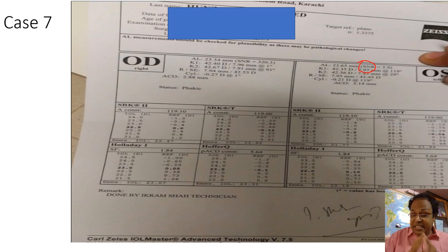Now, the signal to noise ratio can be low in certain cases, for example, in posterior polar cataracts, subcapsular cataracts, maybe in patients with very hard cataracts, right, brunescent cataracts. Therefore, it is very important to not junk your ultrasound biometry machine, because in these cases where the signal to noise ratio is low, you might want to go back to your ultrasound biometry, do an immersion and check the patient's axial length.